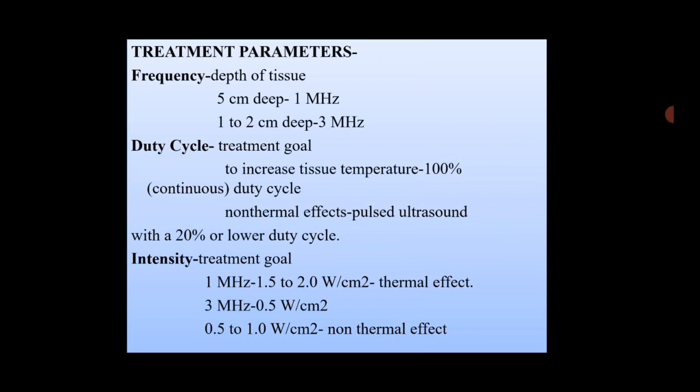Then coming to the duty cycle. Duty cycle is dependent upon your treatment goal, whether you want a thermal effect from the ultrasound or a non-thermal effect. Again, the goal depends upon the patient's condition. To increase the tissue temperature, that is, to have the thermal effect, you have to keep 100% duty cycle. For non-thermal effects, you have to keep pulsed ultrasound with 20% or lower duty cycle.